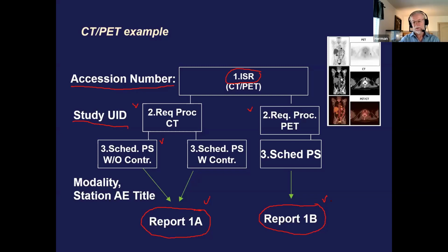So every hospital has a different workflow about it. If you do it right, the system should be able to recognize multiple reports for a single accession number. Many systems don't, so they actually would identify maybe 2 different accession numbers, or a child-parent accession number, or .A, .B. So combo studies are number 1 issue.